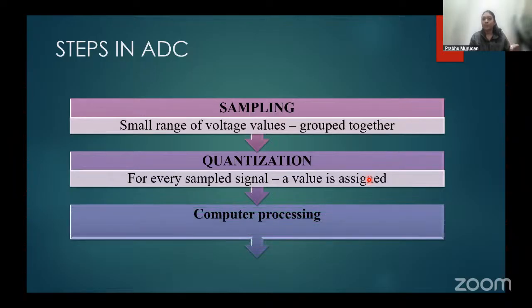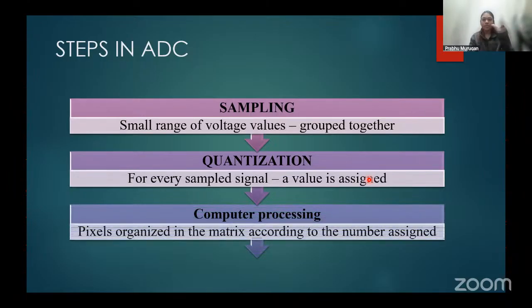The third step is computer processing. Like I told you, the computer is going to process it. It is going to organize the matrix.